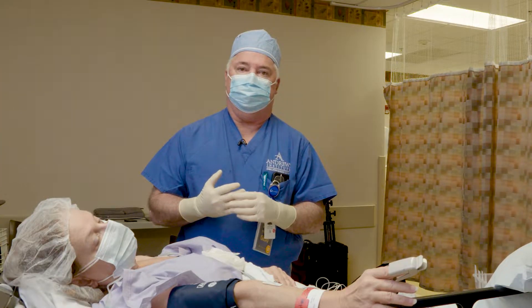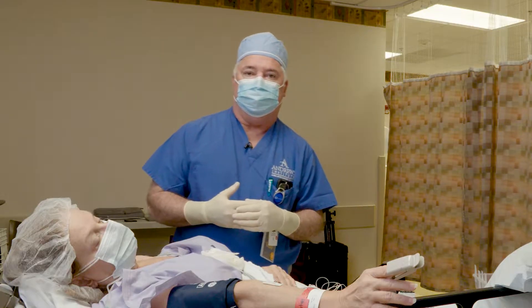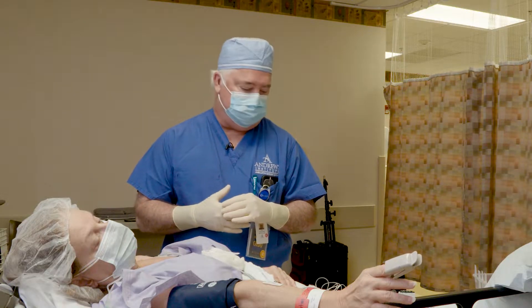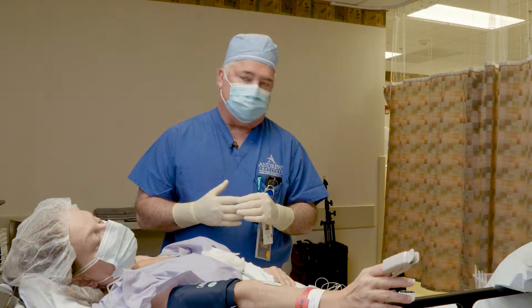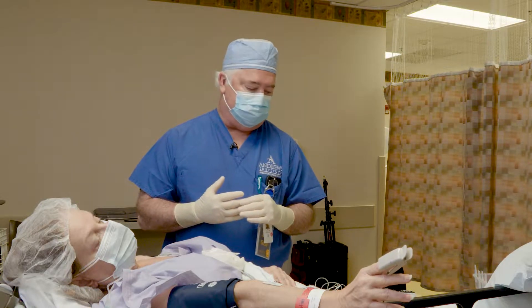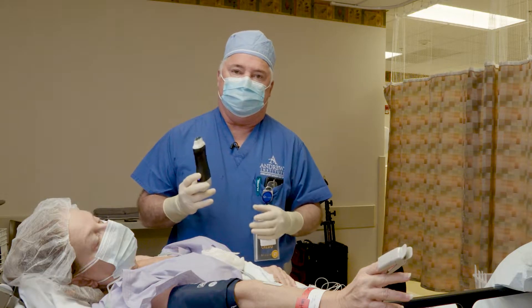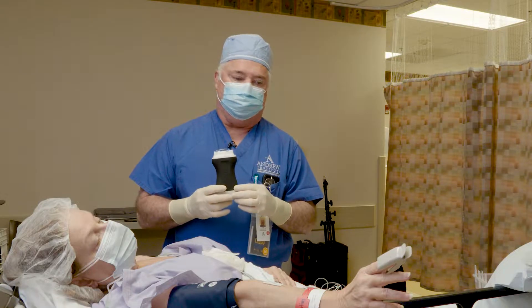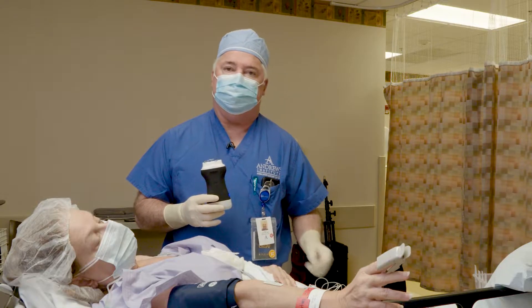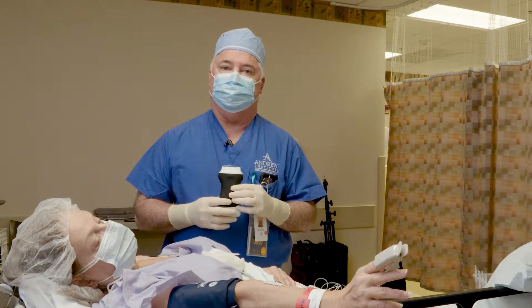Mainly we're going to want to get the corner pocket — the lower part of the brachial plexus, the lower trunk, which will have the ulnar nerve. We'll start there and then work our way up. We're going to use the Clarius ultrasound probe, which is wireless, and we'll use my iPad here to see the nerves on the ultrasound image.